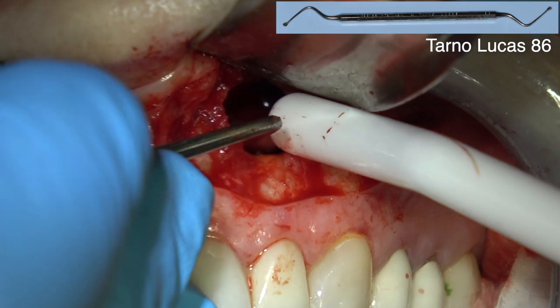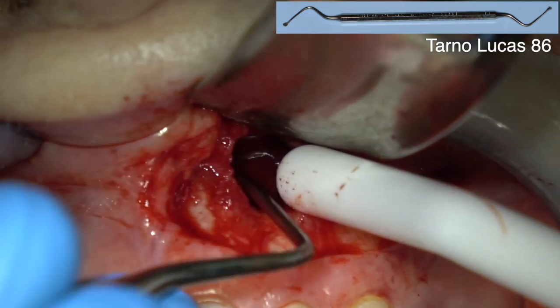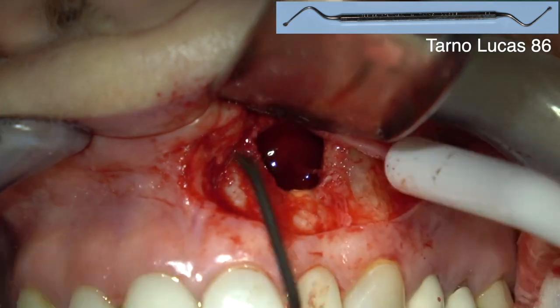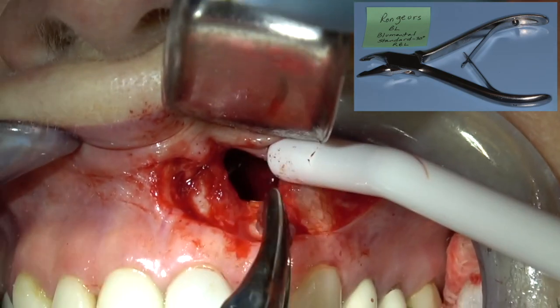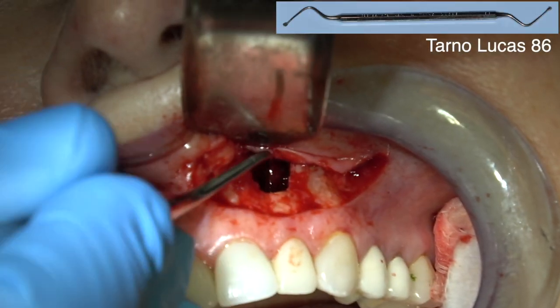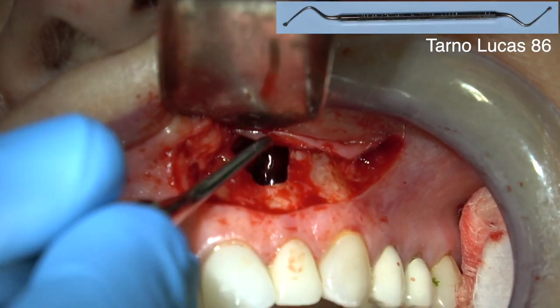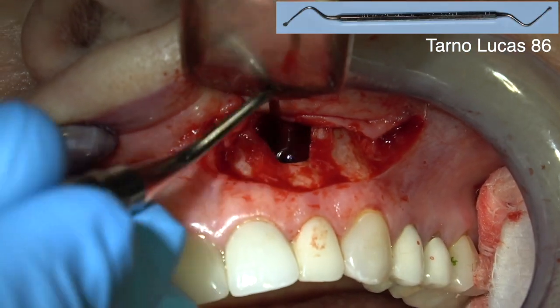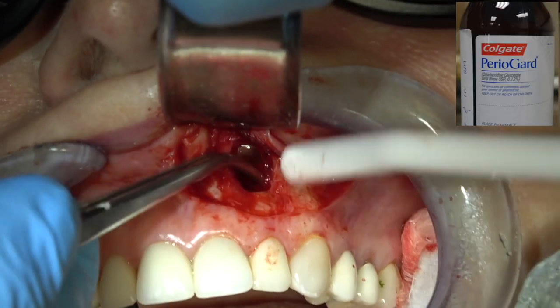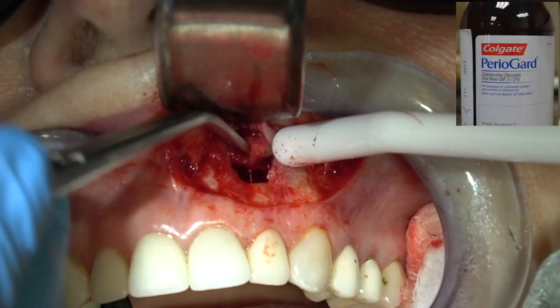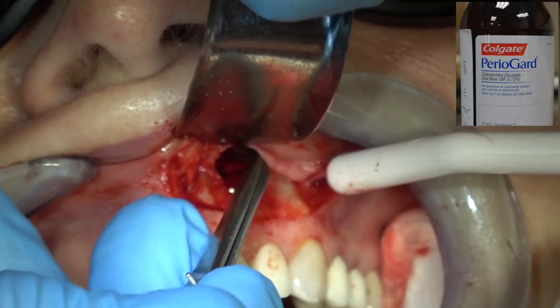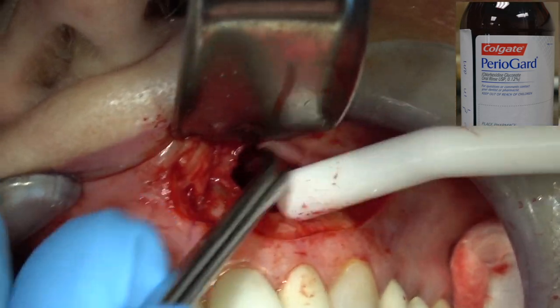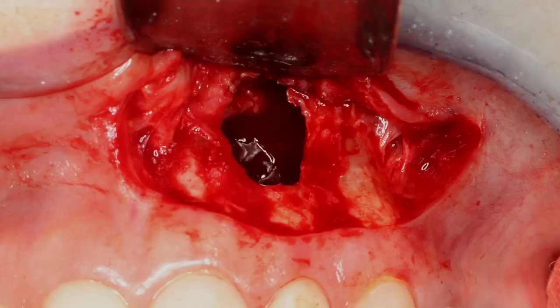The day after this, the patient said it's sore, but the pressure's gone — it just feels so much better. Once I've curetted it all out, the wall should be hard bone. Then I'm coming back in with Perigard or chlorhexidine on a large cotton ball held by cotton forceps and just scrubbing the walls.